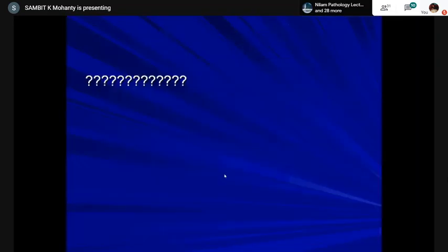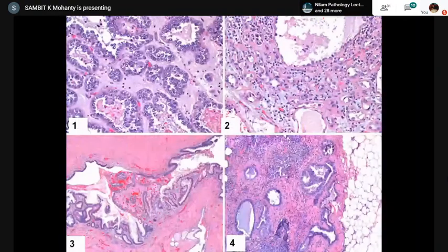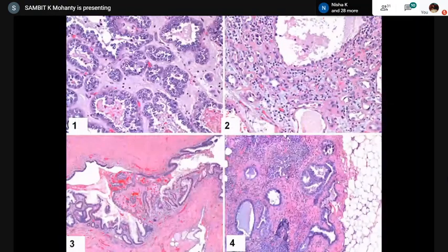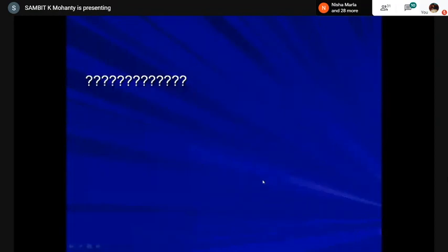Take-home: presence of adenocarcinoma in situ and negative metastatic workup favor a bladder primary over metastasis. Classic architectural patterns and AMACR confirm the diagnosis as clear cell adenocarcinoma rather than urothelial carcinoma with clear cell features. High mitosis, high Ki-67, and p53 positivity argue against nephrogenic adenoma in areas where AMACR can be positive. Absence of endometrial stromal proliferation, presence of ciliated cells, negative CD10, and positive ER/PR with PAX8 support endosalpingiosis.